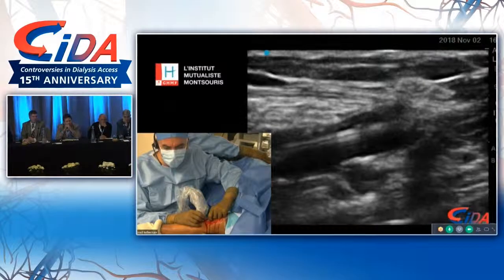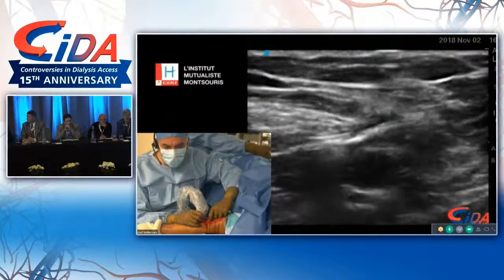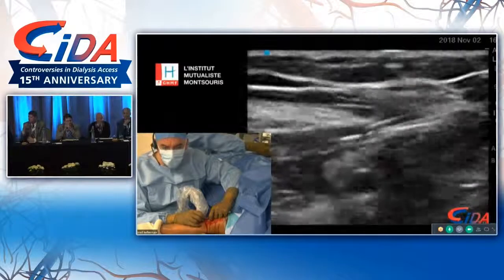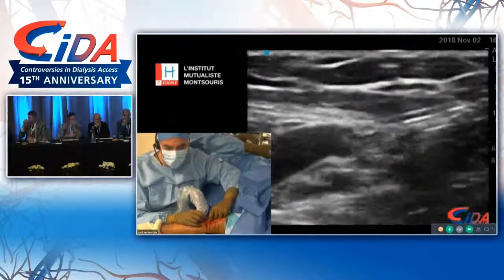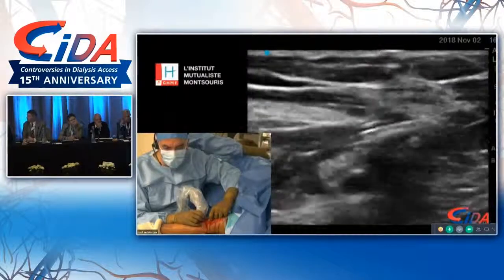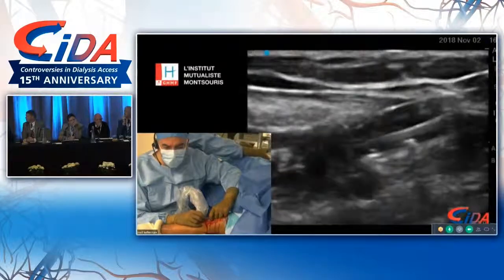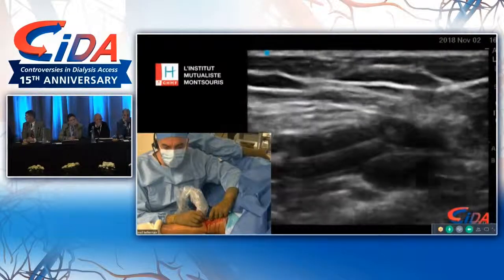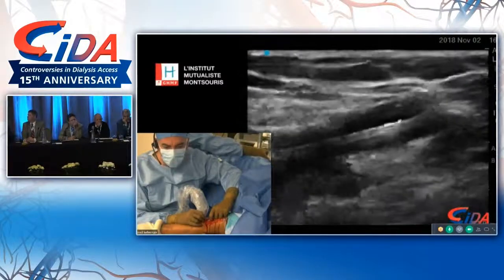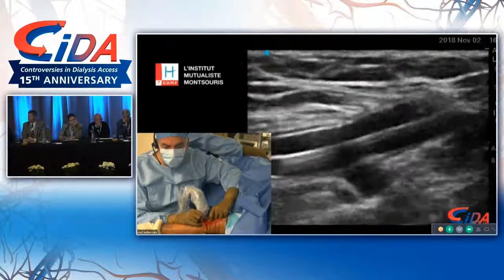Okay, deflate. What pressure are you applying? Nominal pressure, which is 8. This will give you a 5 millimeter, but sometimes we can go higher to get 0.5 millimeter more. The rupture pressure of this balloon is 13. How long do you hold the inflation? We're doing a few short inflations, and probably at the end of the procedure, we'll do a bit more prolonged one. So what I want to see is everything well dilated from the artery, the anastomosis to the perforator.